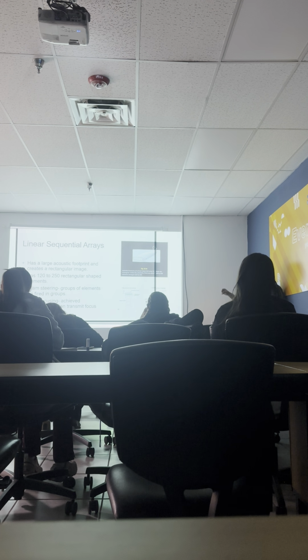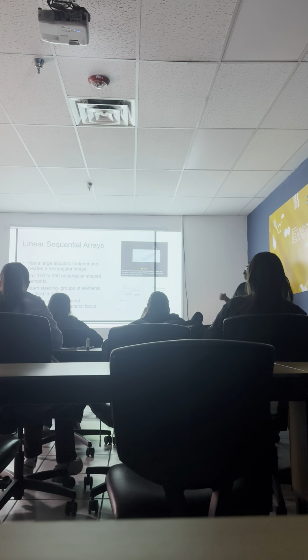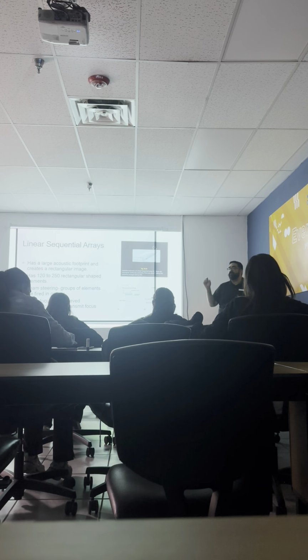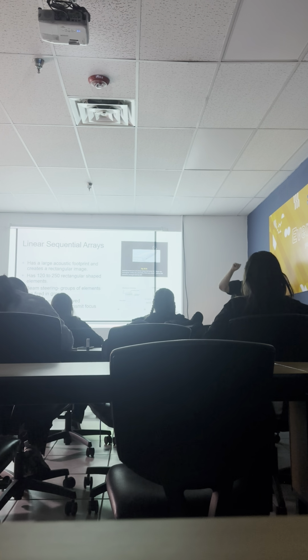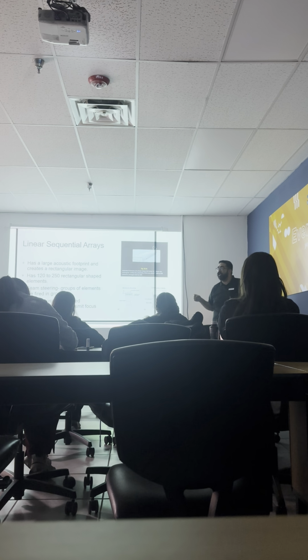Now with focusing, focusing is different than steering, right? How? Focusing is when the sound beam starts to narrow. Yes, the depth. Steering just tells us which way to steer the beam. The focusing will tell us how deep to put our focus. And what is our focus? The narrowest part of the beam. And at the focus, what resolution is the best? Lateral resolution is the best.